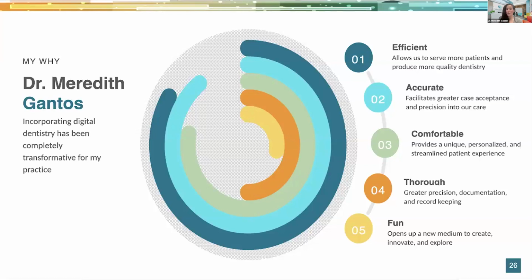And then, of course, the fun of it, to your point, always challenging yourself to really think creatively, to problem solve. To me, that's been some of the most fun, especially with printing and milling. We can have an emergency patient walk in with a fractured tooth and leave with a 3D printed flipper or bonded Maryland bridge while we've extracted it and bone grafted it. Someone else is doing that, right? And they can walk out with that within 60 minutes. So it just creates this whole new way of trying to think creatively to solve the same problems we've always solved.